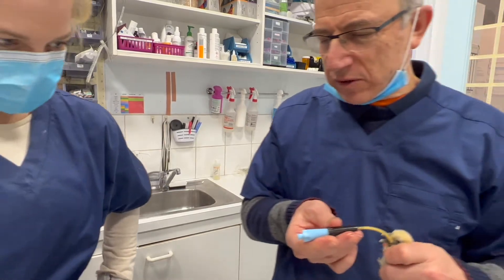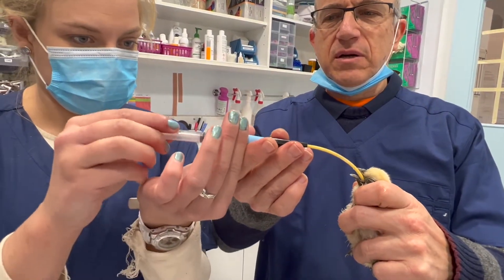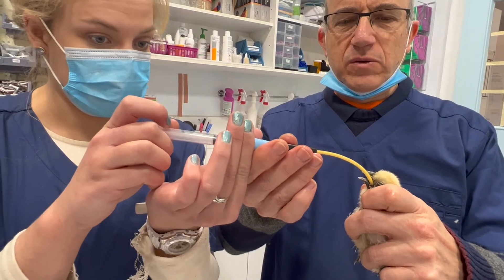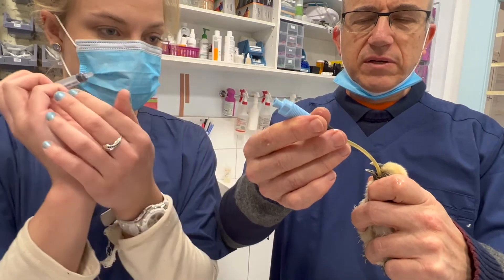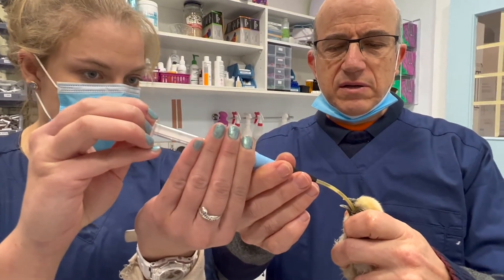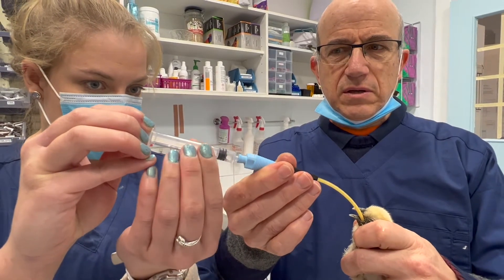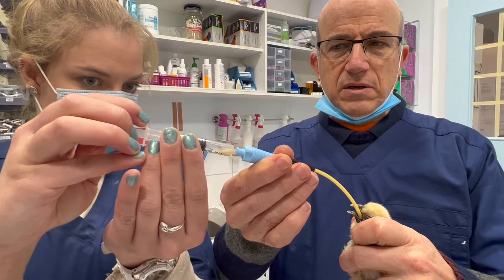I want you to take one that's got water in it — that one. Inject it in, please. Slowly. No, put the syringe back on. Don't take it off, please. Put the syringe back on. Okay, suck again. Hallelujah.